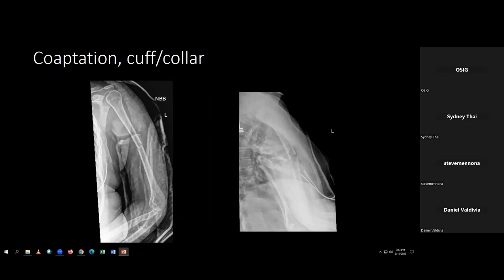Now it's a little bit angulated. If you look at this, this isn't a scapular Y view. This is called a transthoracic lateral, meaning they basically shoot through your thorax. So we make them hold a bar up, they take a deep breath to inflate the lungs, and their arm is by their side. So they just shoot through, because it's hard to get a real lateral where you're moving their arm up if it's broken and there's all this padding in there. But you can still see it's a little gapped anteriorly, and it's angulated a little bit.